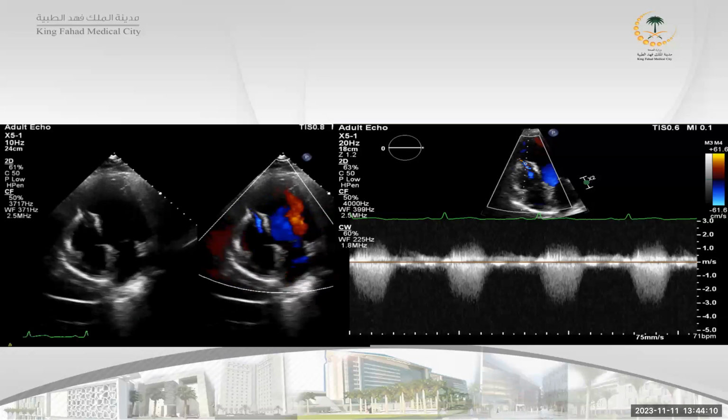Okay. However, VSD with double chamber RV, double chamber RV. Okay. Why did you say double chamber RV? It's not easy to diagnose this just from this view. And this is usually a very complicated congenital disease. You have to see the short axis and whatever in echo, and it's even not easy to diagnose just from echo. You have to do sometimes CMR, and they have typical findings on examination, and it is usually diagnosed in childhood.